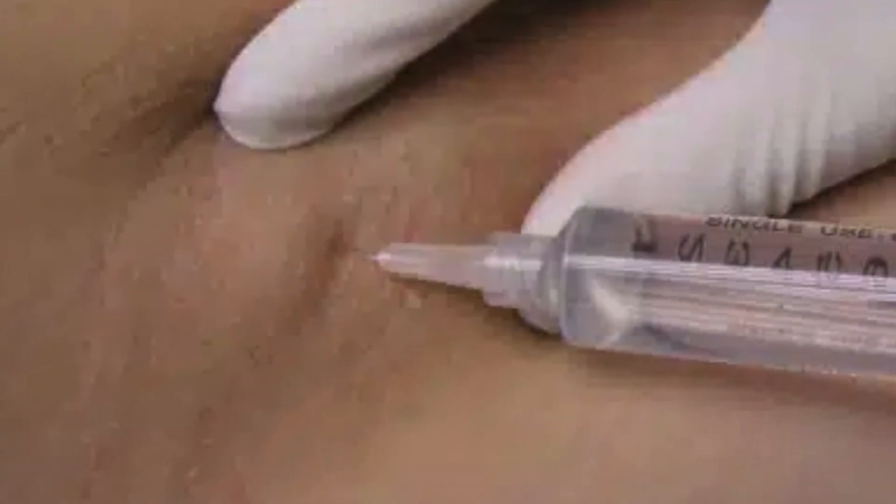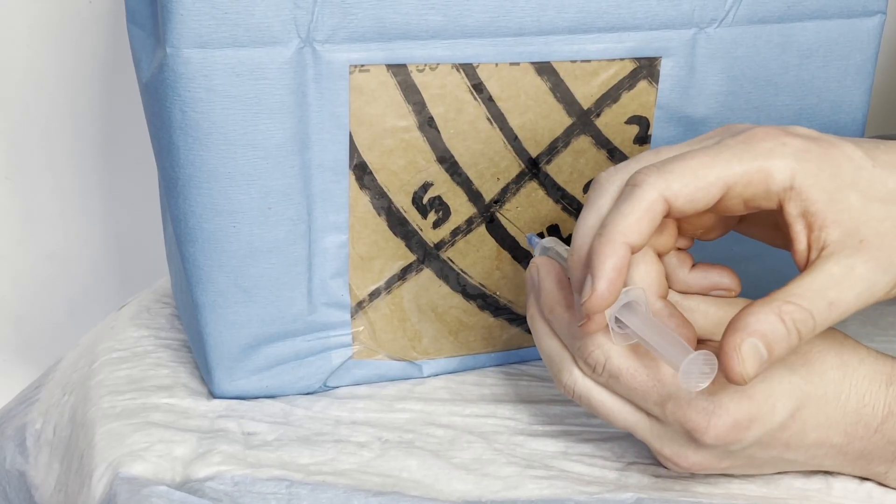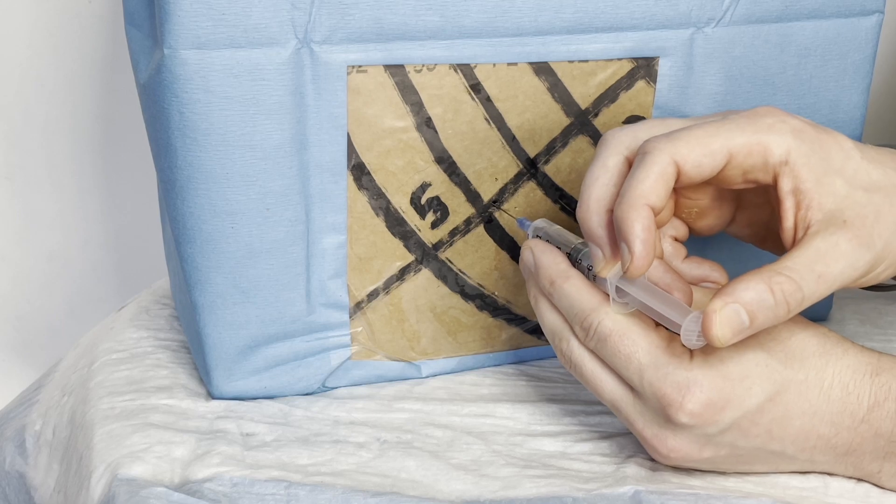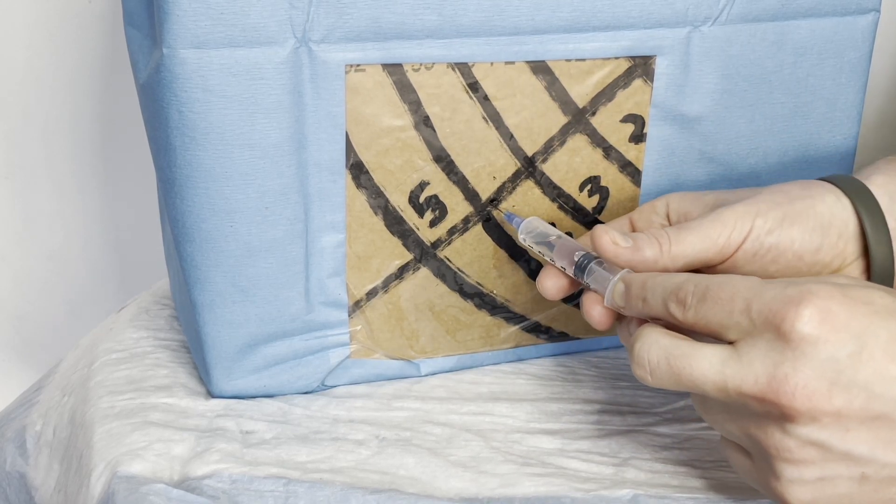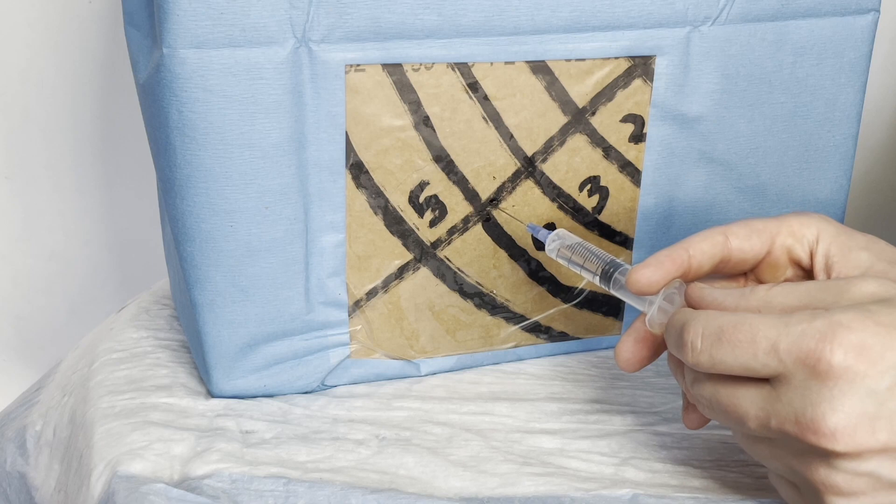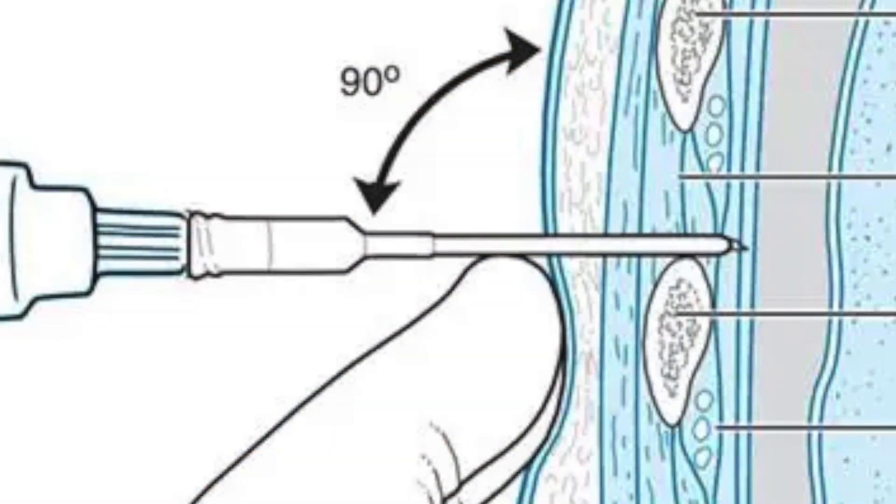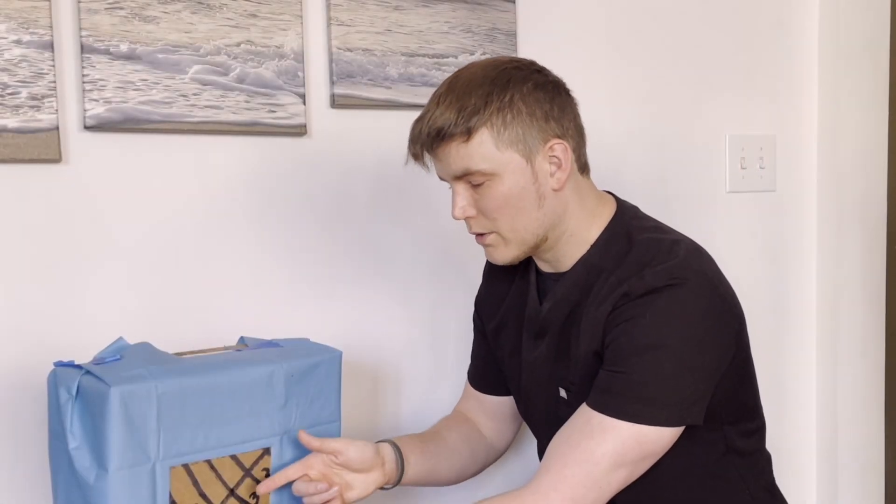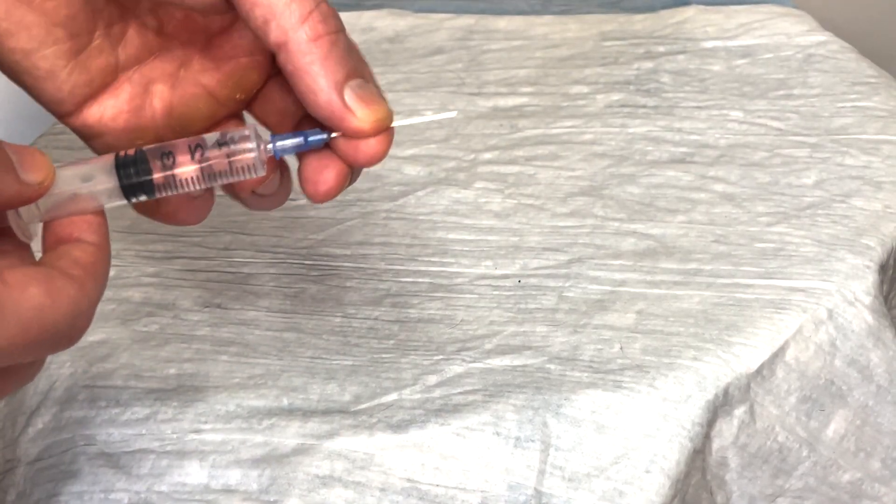And now that we've created a superficial wheel, we can move on to deeper anesthetize the procedure site and get into the pleural space. So now with our longer needle, we can start to inject and then we can slowly aspirate as we get closer to the pleural space and we're going to get some bubbles. And as soon as we get bubbles, we know that we're in the pleural space. We can pull back a little bit and anesthetize the space between the pleural space and the intercostal muscles. So inject liberally into there, and you're also going to know where you got the bubbles, so you know how far you have to go with your introducer needle into the space. So we've anesthetized this area really well. Our patient is nice and numb and ready to move forward with the next step.